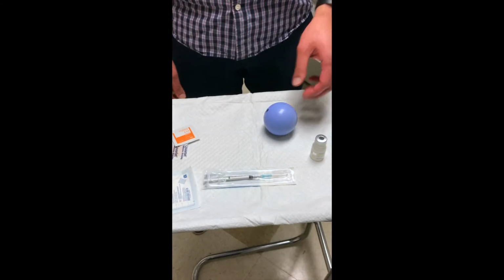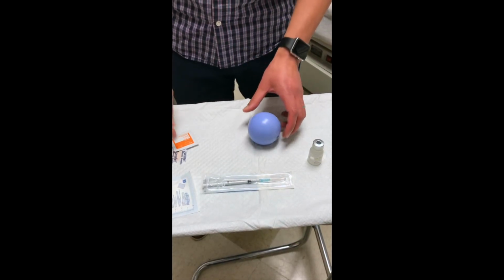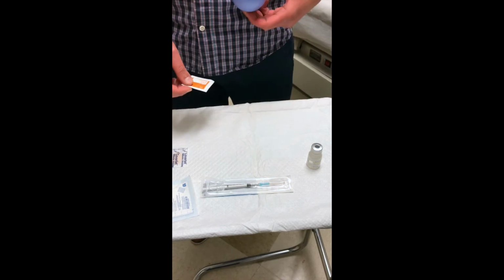The one thing to remember when you're injecting is just trying to switch the sides every time you inject, just to give your body some time to heal. So if you're injecting 1 week on the right side, just try to remember if you can inject on the left side the following week. For the purposes of this demonstration, we're going to use this ball and we're going to inject into this ball and pretend that this is my belly.